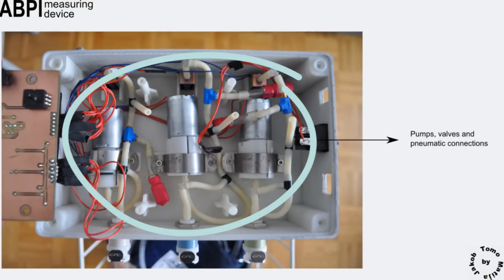Below the PCB, pumps and valves are fixed to the housing. They are connected by rubber hoses. When the sensors are connected to the pneumatic system, the entire system is hermetically closed.